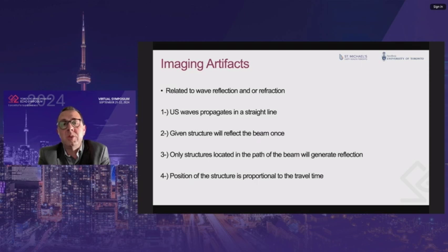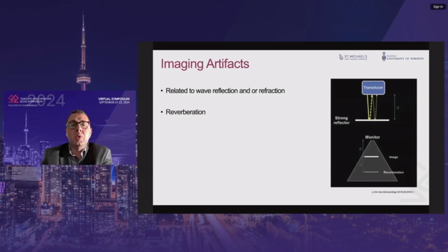And also that the position of the structure is proportional to the travel time. Every time one of these assumptions is violated, we have the creation of an artifact. Probably the most common artifact that we see in our daily practice is the reverberation artifact.